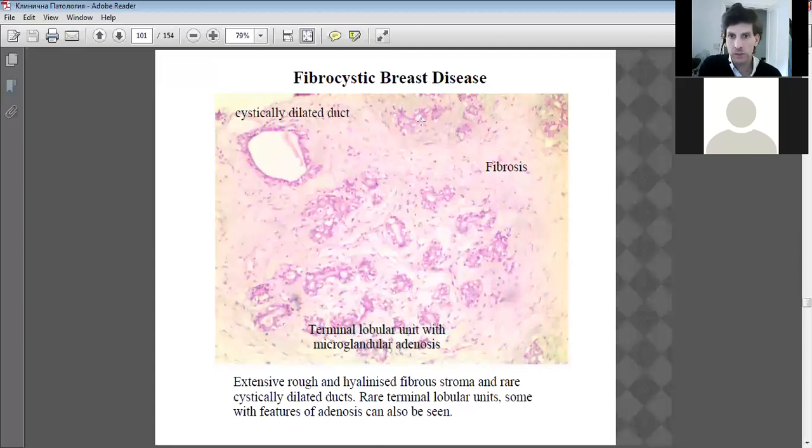Normally you'd find lots of these throughout the tissue, but you're getting more fiber forming, so isolating these areas. And this is why he calls them terminal lobular units. So units start to form in sections of the tissue. That's a bit abnormal. They are rare. They're not normal.